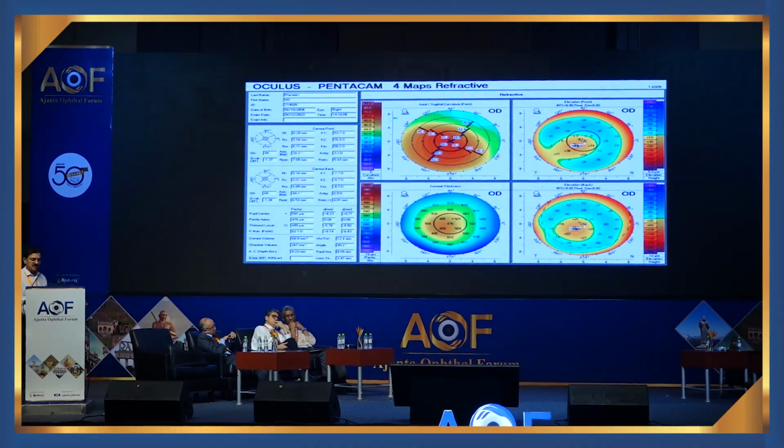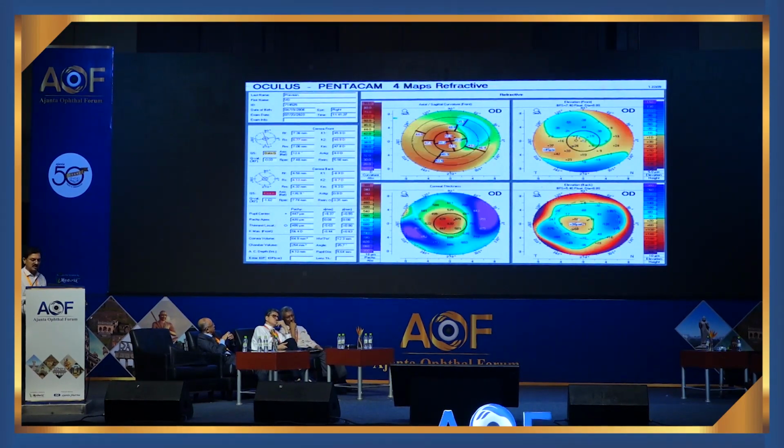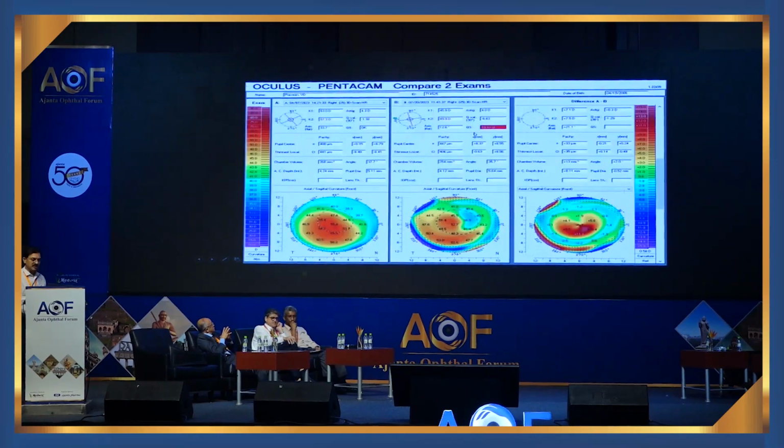And this is another case with a central cone and 360 degrees. We did a 320 here, and still we erred a little bit. We got more flattening here, and this can be learned over a period of time. And this is the pre-op and post-op comparison, up to 11 diopters of correction. We cannot get 11 diopters of flattening with Intacs, which is fantastic with this.